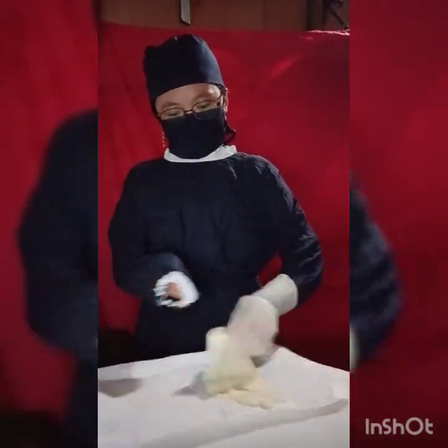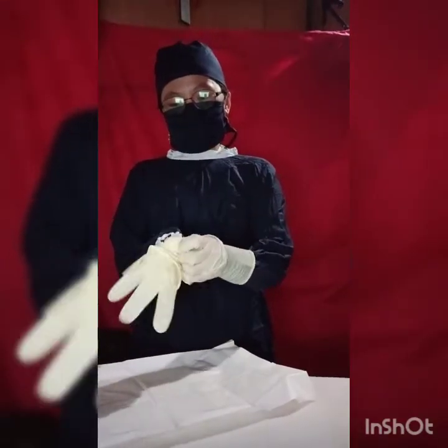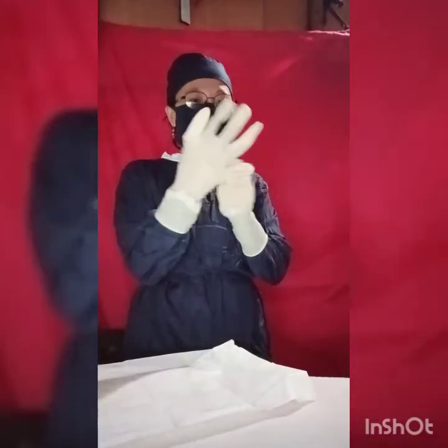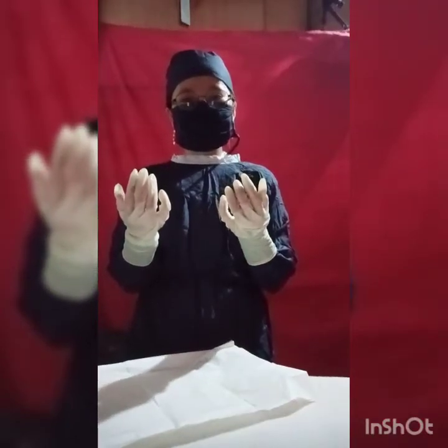So, place the fingers of the gloved hand under the cuff of the remaining glove. Then, place the glove over the cuff of the second sleeve. Extend the fingers into the glove as you pull the glove over the cuff. So this is now the closed gloving.